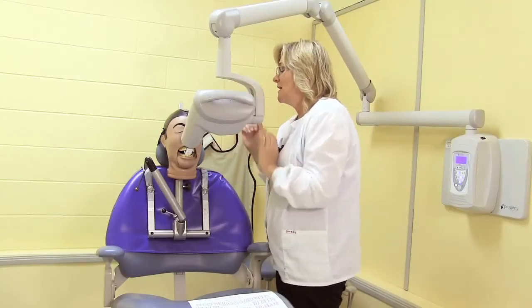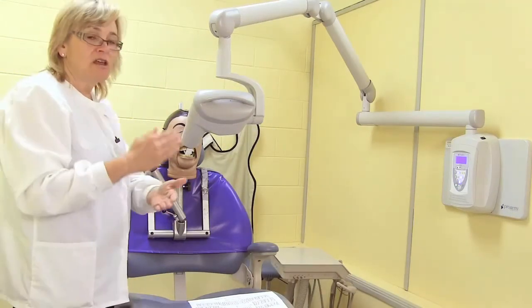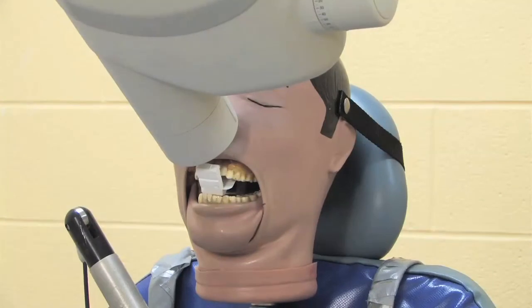In our case today, as I said, there's a shallow palate. And one of the things that we worry about with a shallow palate is that if our vertical angulation is too low, then that increases our chance of elongation. So I will adjust it accordingly.